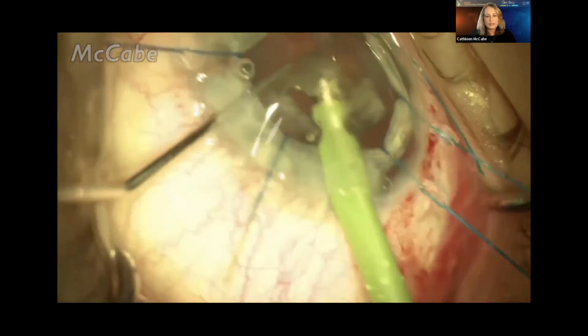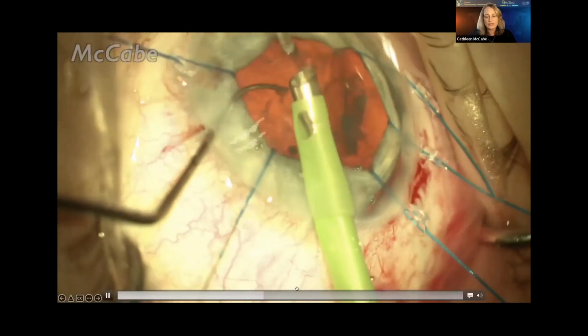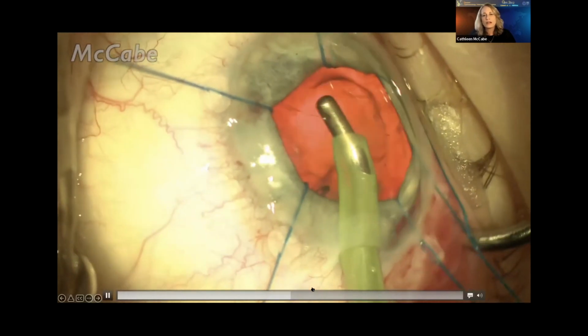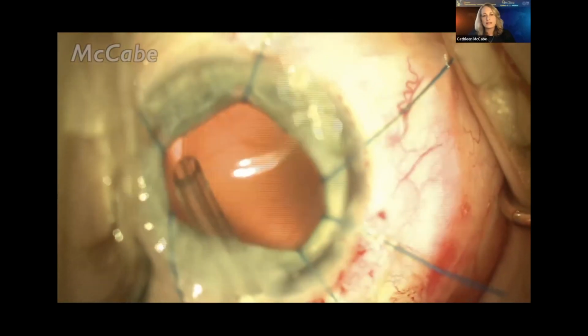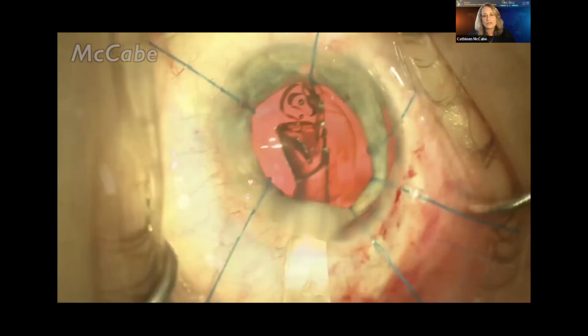So I'm going to go a little bit forward of here because there's not a lot of excitement that happens, thankfully, during this portion of the procedure. I'm going to just continue these same principles, and I will put a CTR in because I did see that flattening of the margin in the area, although this patient thankfully did have some pretty good zonules there.